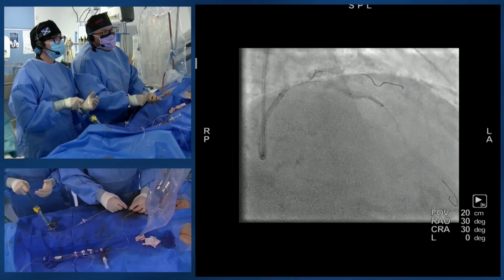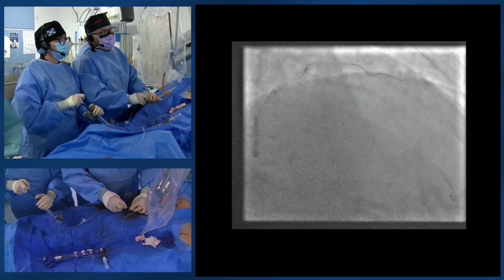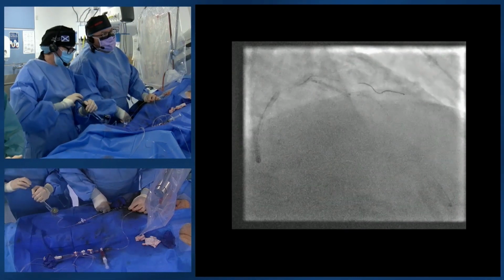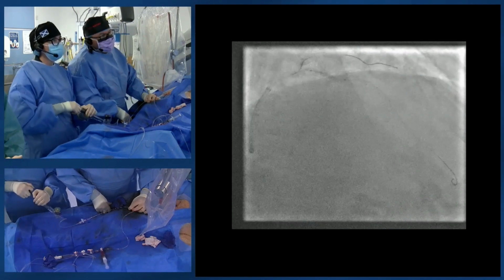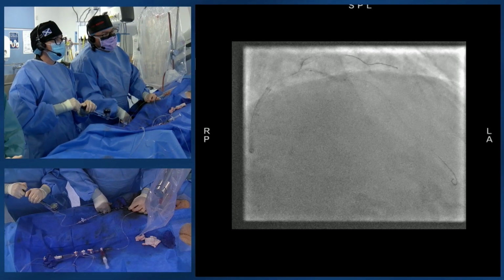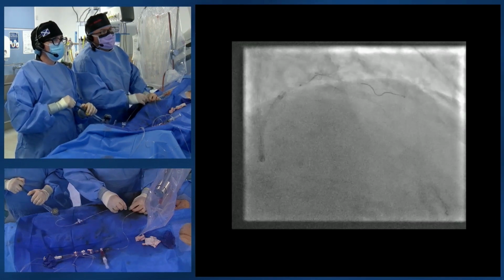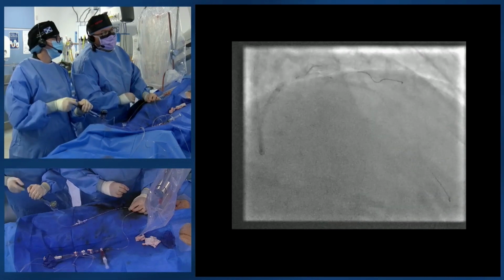It's angiographically definitively severe. So I think what we do is progressive balloon dilatation and IVL, if we can get it to track down to that segment. You see there's an angulation issue where the calcium is severe. It's often interesting how that's often the case. The severe calcium is at the location of the severe tortuosity. Yeah, that's right, with the flow dynamics. So that's me up to 20 atmospheres, but it's a small balloon, so we're going to progressively work our way up. So do you want to see if that previously used 2.5 NCB will track?